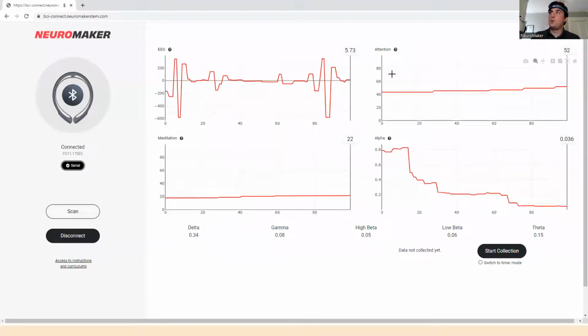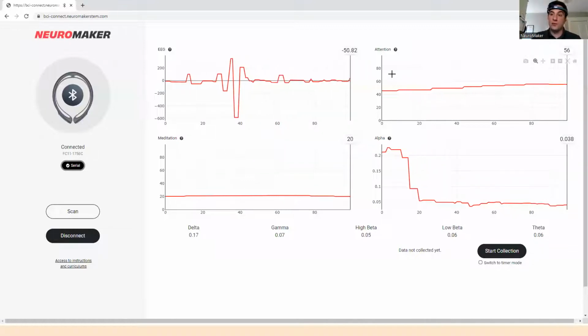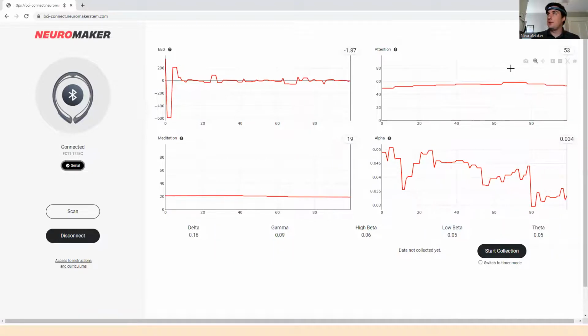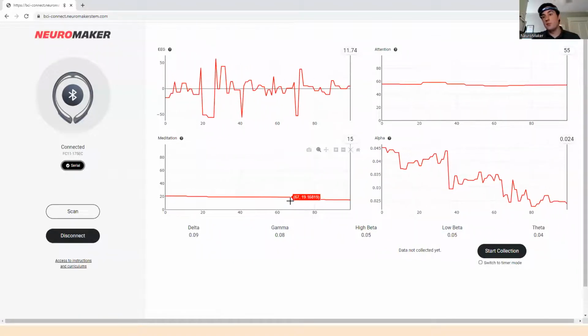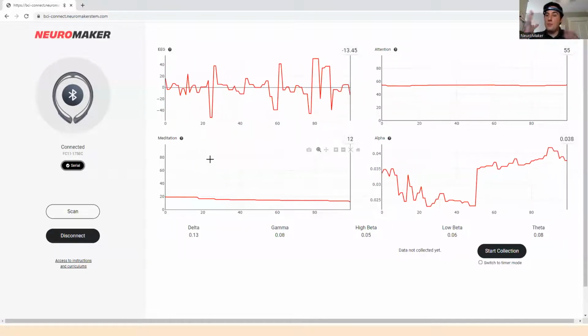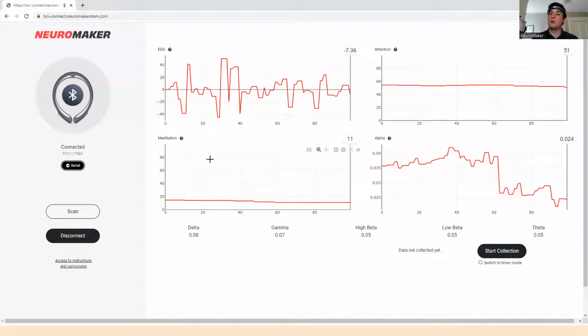You can see here there are two plots, and I'm going to make this a little bit interactive for you all, but I'll just introduce it briefly here. We have two specialized plots. Let me start with the meditation one first. We worked with a number of meditation experts in Boston, and we mapped the brain signals that a meditation expert would have when they're meditating.